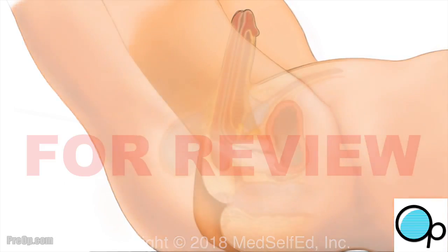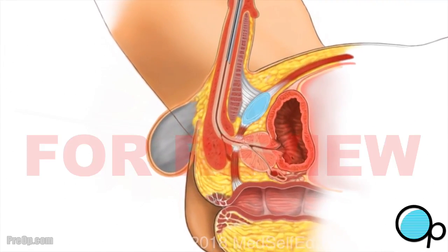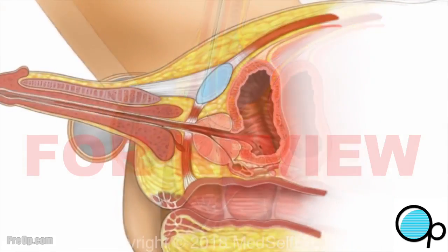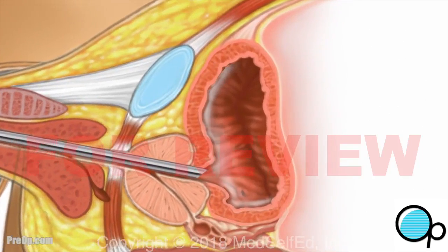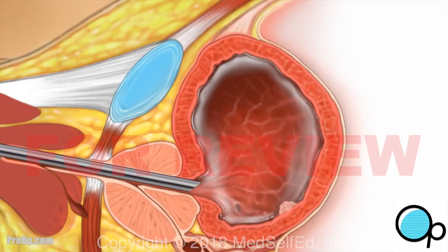Now let's talk a little more about what happens during a TURBT. To start, you are given anesthesia to keep you free of pain during the procedure. You are positioned carefully. An instrument with a camera called a scope is then gently inserted into the urethra. A numbing gel is used to help the scope glide easily. Once the scope is inside the bladder, your doctor will fill your bladder with water or saline.